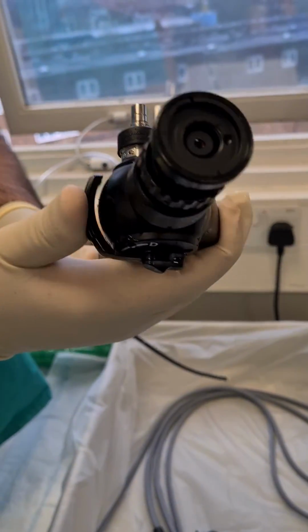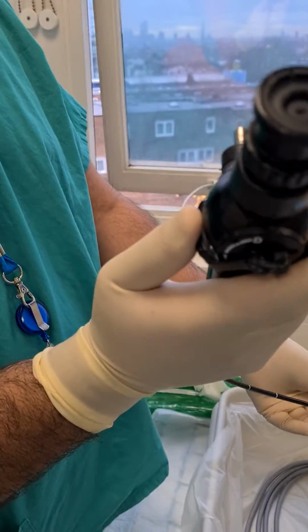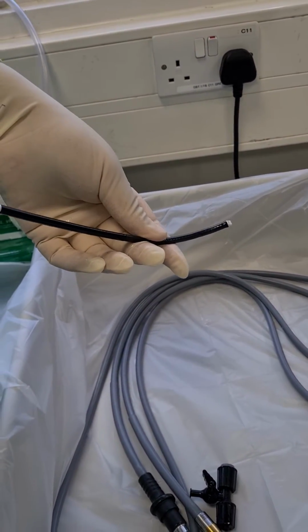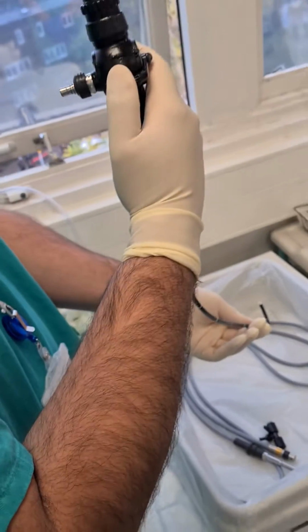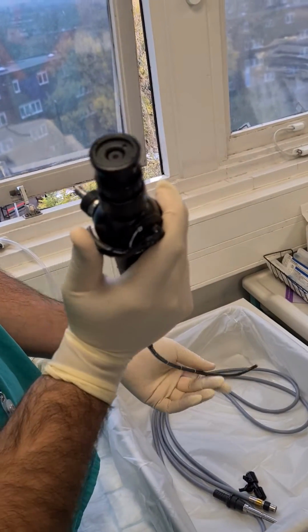This is your hand piece from which you can rotate it. You see, when you go, focus here, please. When you go down, it goes up, and when you go up, it goes down. And by rotation of your wrist, you can manipulate it to 180 and 180 and see the entire wall of the bladder as well.